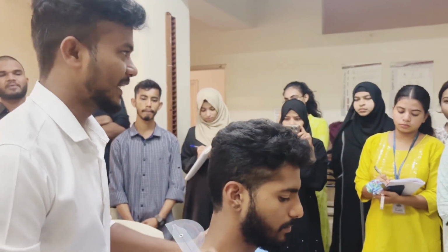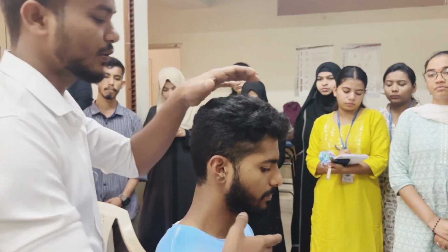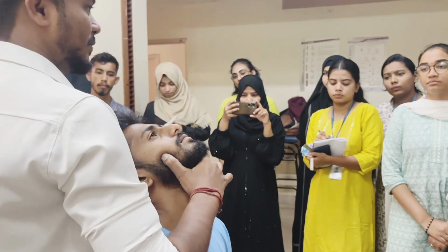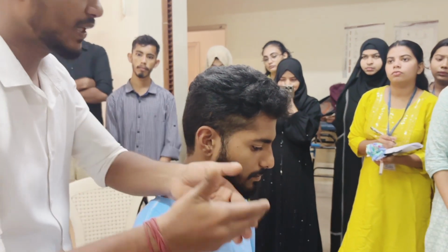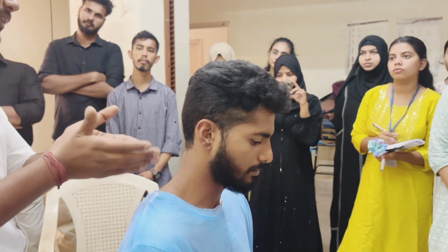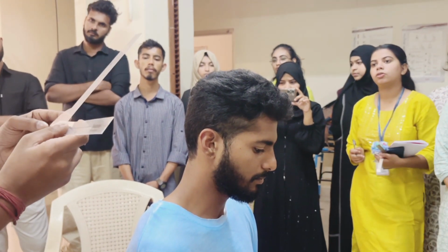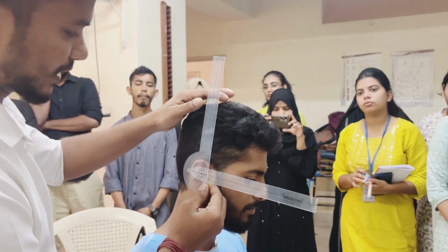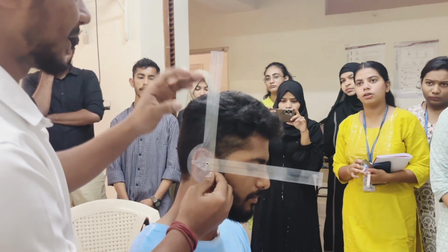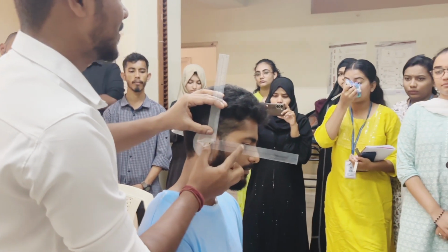Now we will see extension. Extension is also the same. The position of the patient will be the same, high sitting position. First we will do extension passively once, so the patient will understand that's the extension movement. Whenever you ask the patient to do extension, he will do it easily. Again we keep the 90-90 degree position, with the fulcrum over the external auditory meatus and the movable arm at the base of the nose.